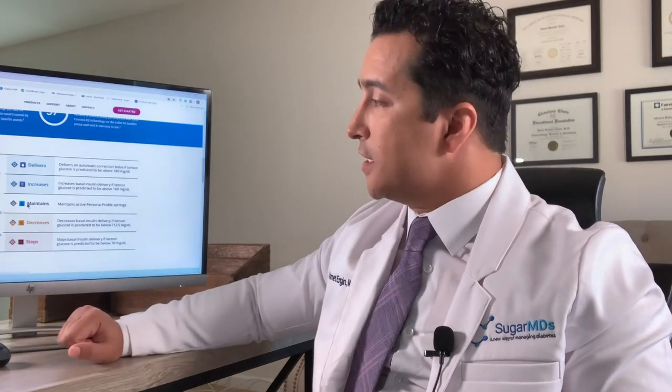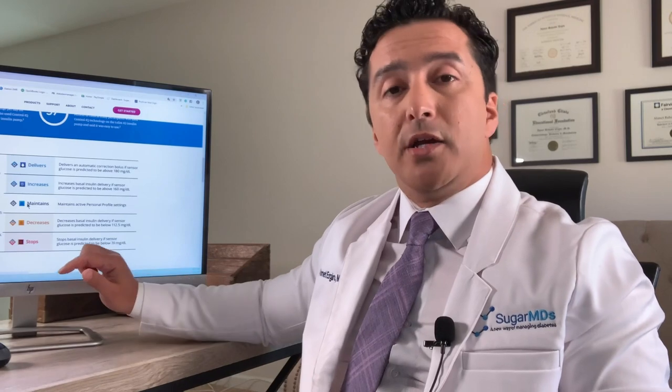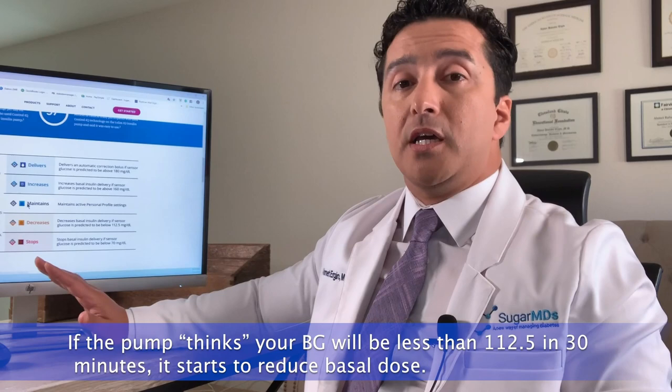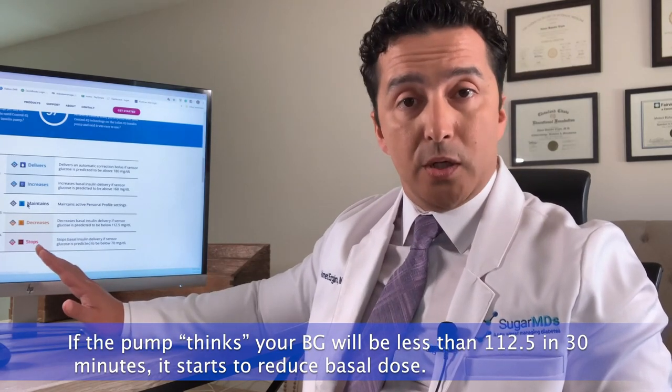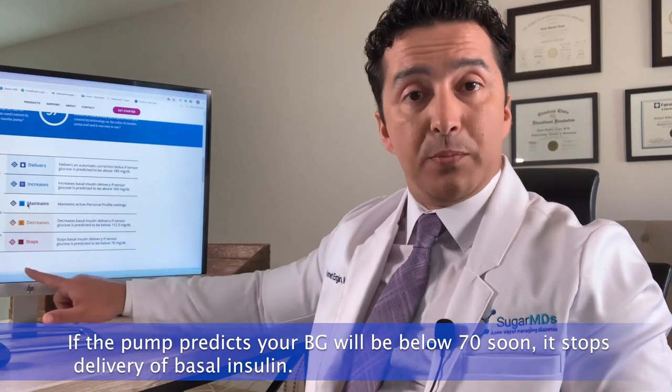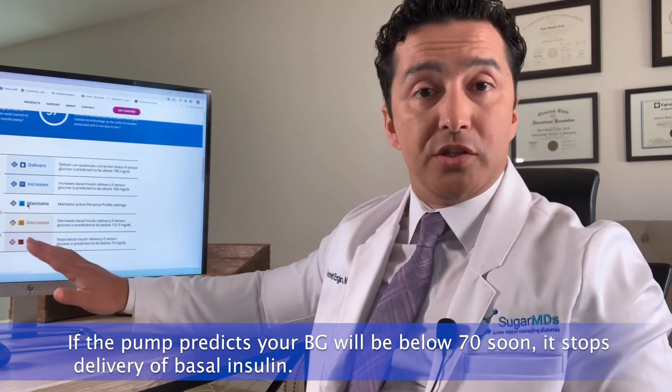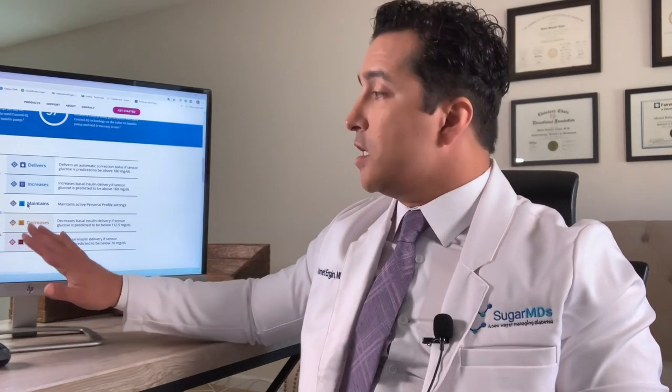There are multiple layers of blood sugar thresholds in Tandem. If the pump predicts your blood sugar will be less than 112.5 mg/dL in 30 minutes, it starts reducing your basal dose. If it predicts you will go below 70 mg/dL very soon, it completely shuts off basal insulin delivery.